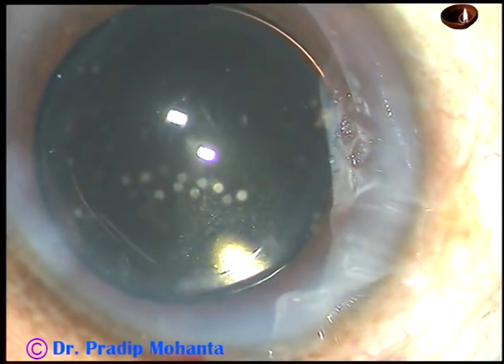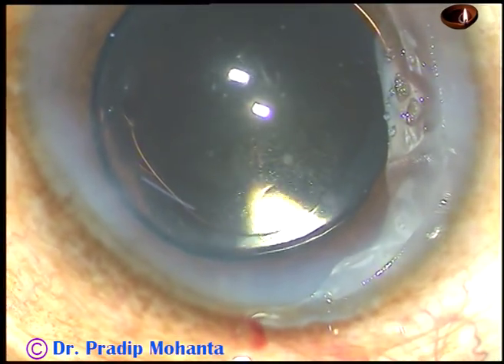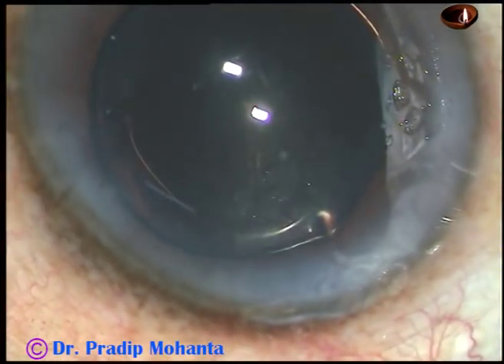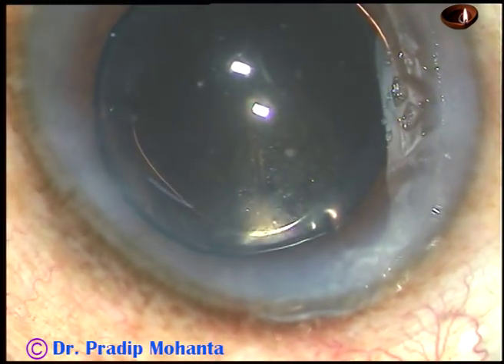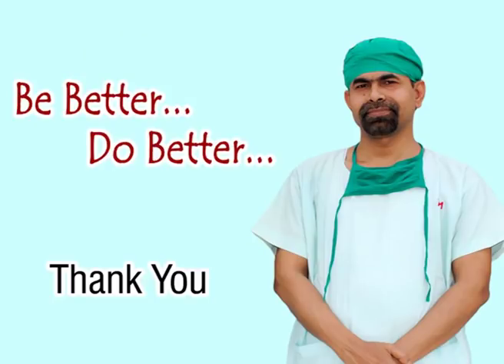Now hydrate the sideports, do the final lavage, form the anterior chamber, and conclude the case after checking the wounds. Thank you very much for your attention. Hope this video will give you many tips in developing your surgical skills.